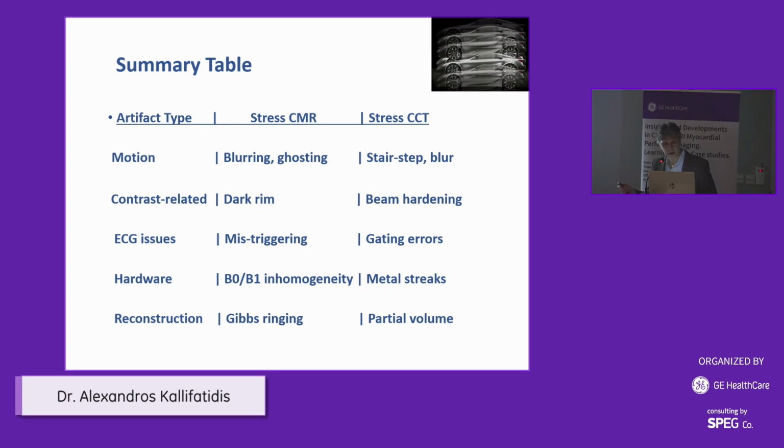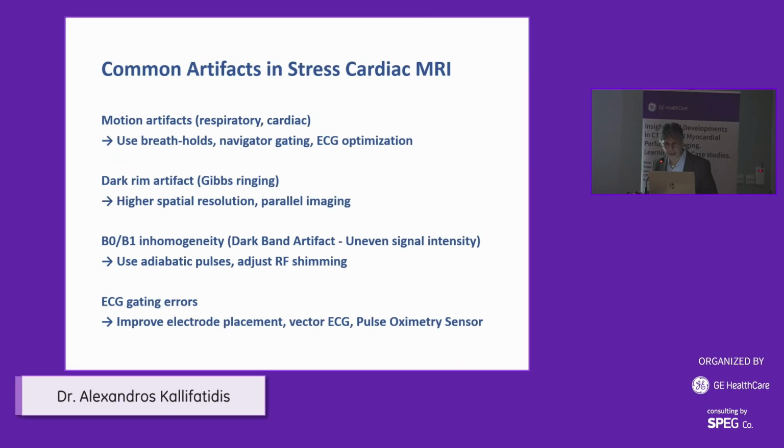So this is a summarizing table with the most common artifacts in stress MRI and stress CT. There are different techniques that we can use in order to overcome them. We can discuss it maybe later in a discussion or during the workshop.